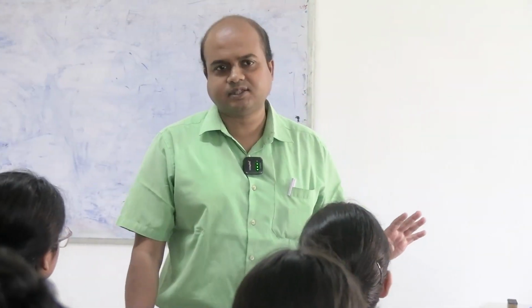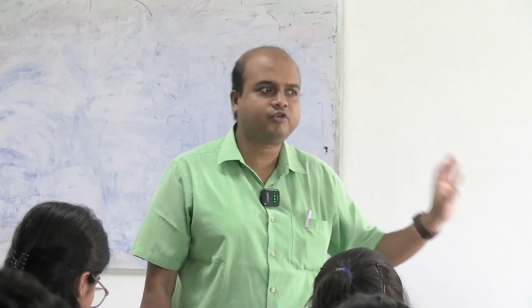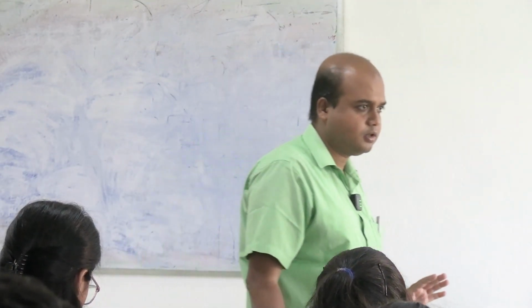If you count 100, 200, then 1 or 2 may come. Okay. So basophils are very few in number. At least as beginners, it is better to not comment any cell as basophil. So practically you comment neutrophil or eosinophil or lymphocyte or monocyte. So my suggestion will be not to comment any cell, this is a basophil.